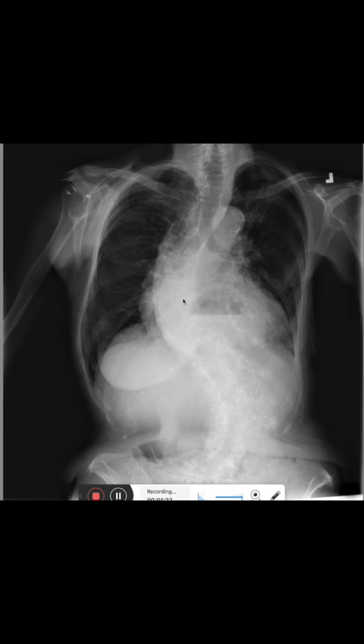We can also see these three foreign bodies here in projection to the humeral head. Those are anchors that are used to reinsert a tendon into the humerus.